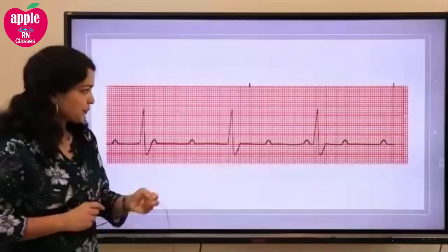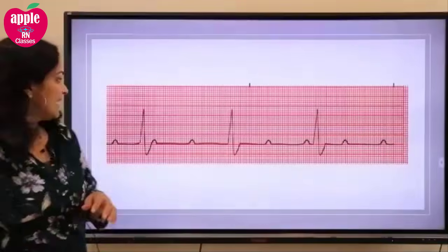Next one. How about this one? Might look a little.